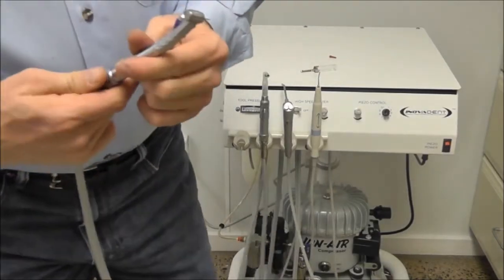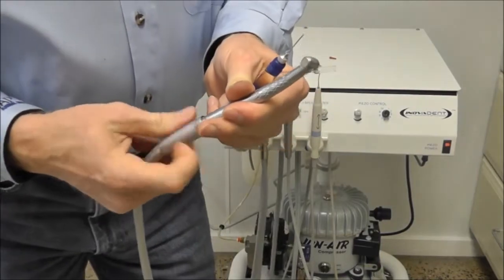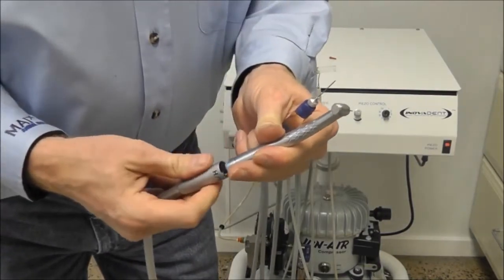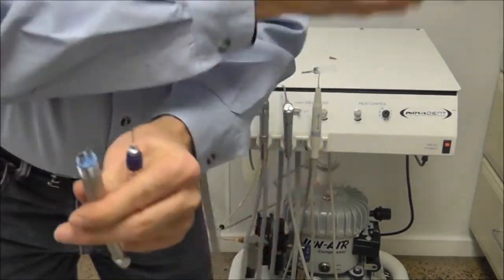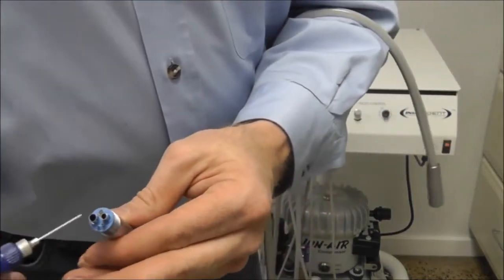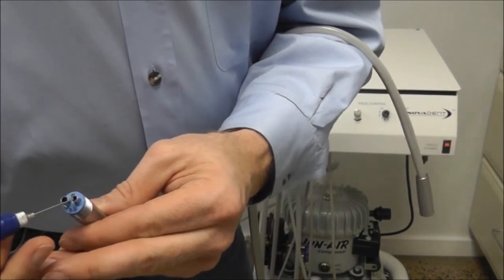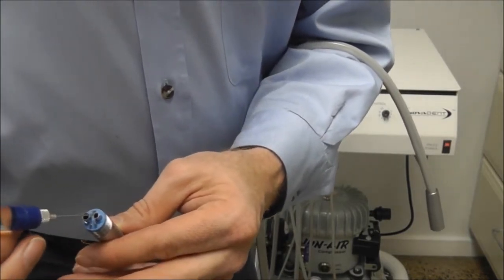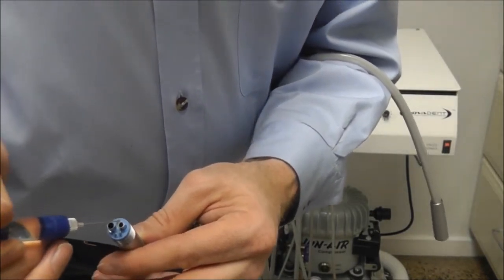We'll go ahead and oil our high and low speed hand pieces. Remove the high speed hand piece from the dental cart. We have two larger ports and we'll place the oil down the smaller of the two, giving it two or three drops.